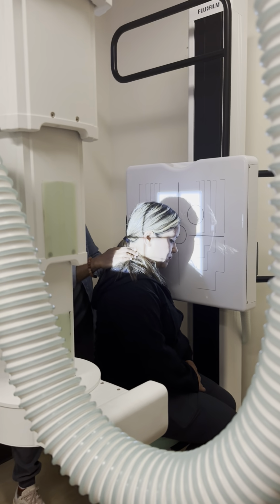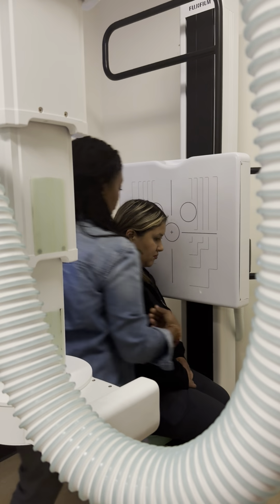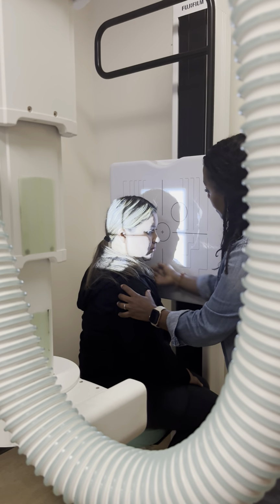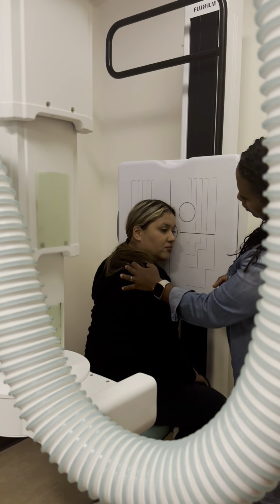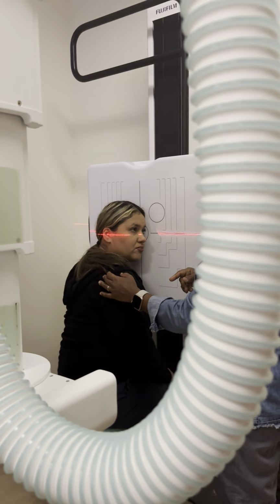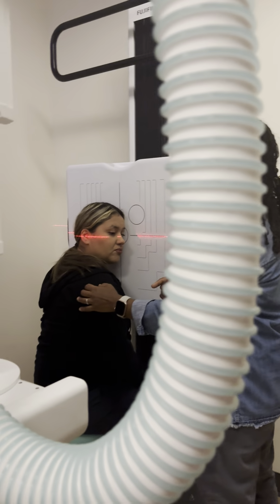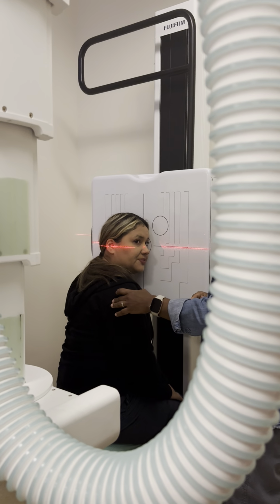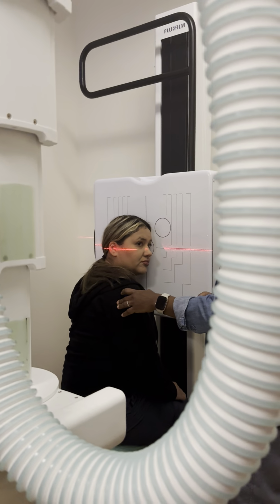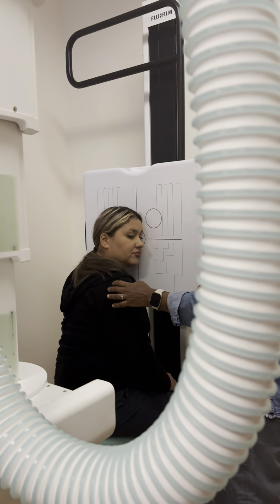Yeah, so she needs to oblique her body and then get her face, Mr. Hollister, as close as she can get to it. This is the infraorbital meatal line. So that one was a regular PA, not a Towns. Correct. And the Towns is always projection AP, 30 degrees, so there's the OML line. It's only AP.